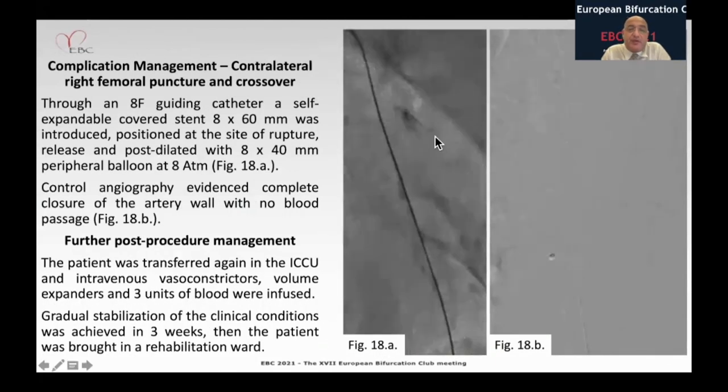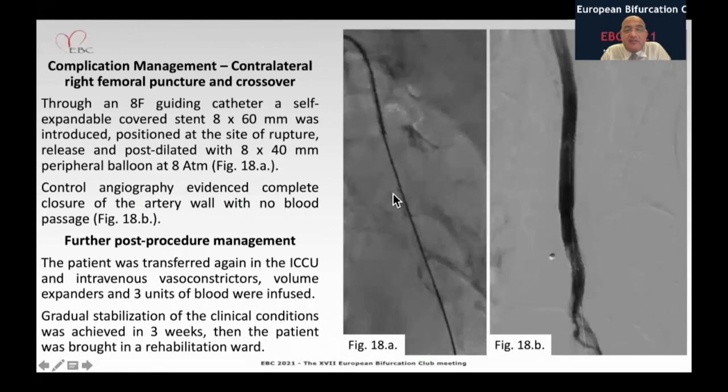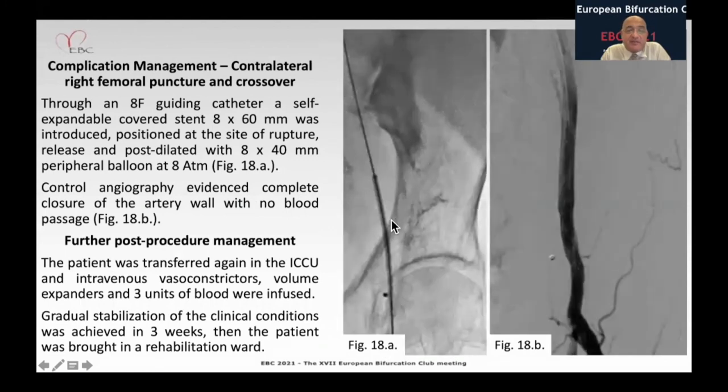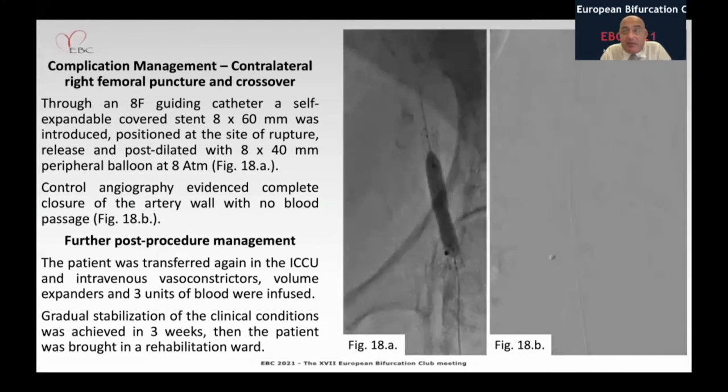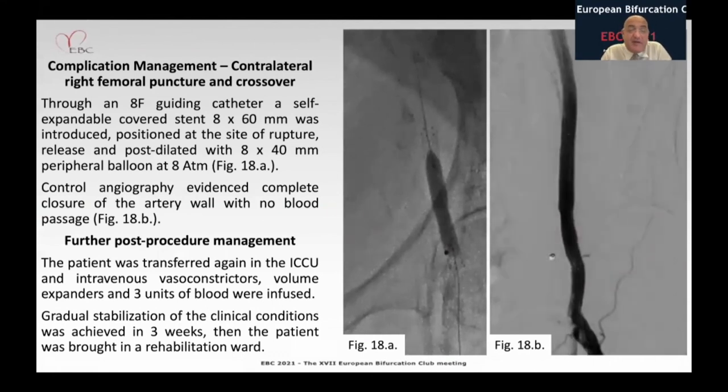So we put a cover stent on this place here. You can see the cover stent, and the final result was quite good. The patient remained in the cardiology department for at least 2 weeks, and after that she was transferred to the rehabilitation unit.